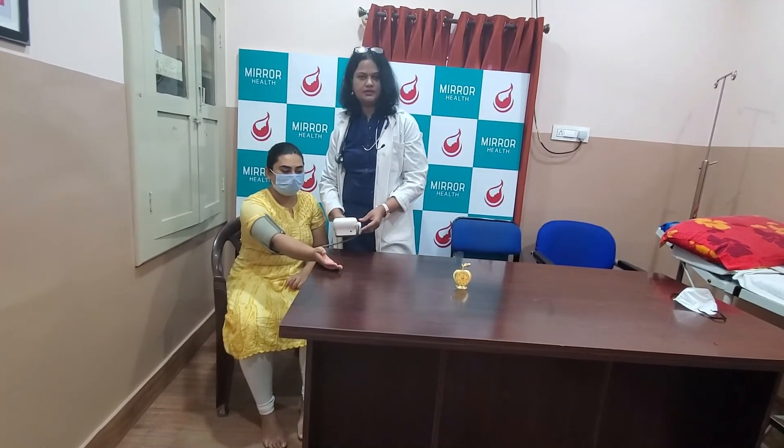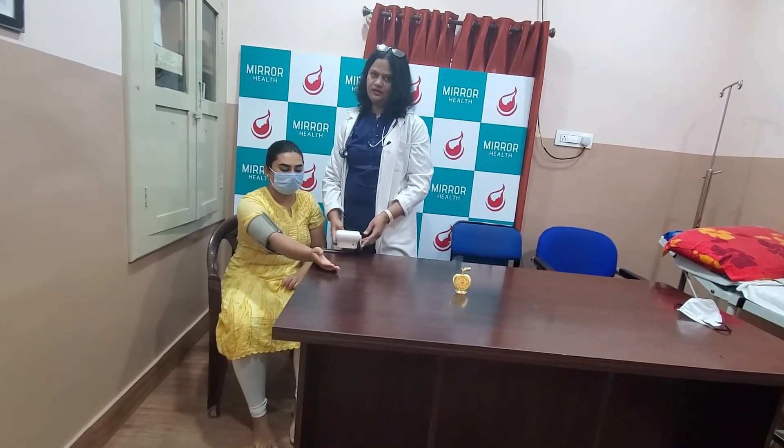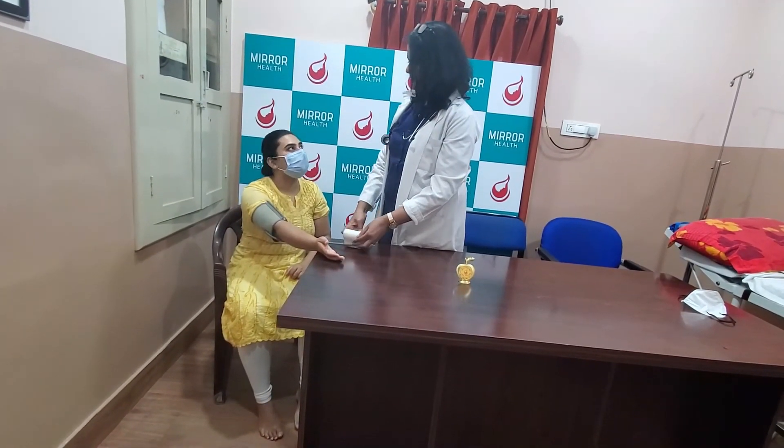So I have the reading. It is 117 by 69 and it is normal. Your blood pressure is normal, Mrs. X. Thank you.